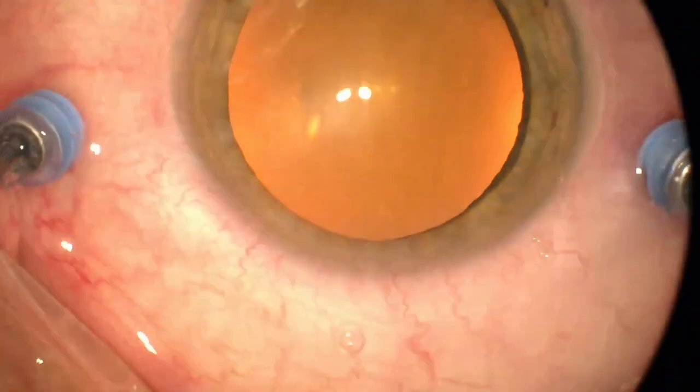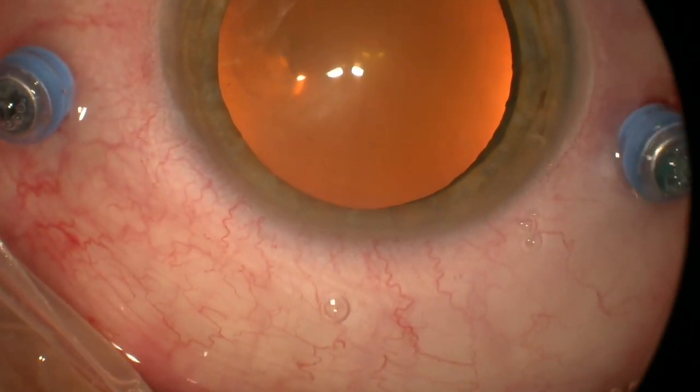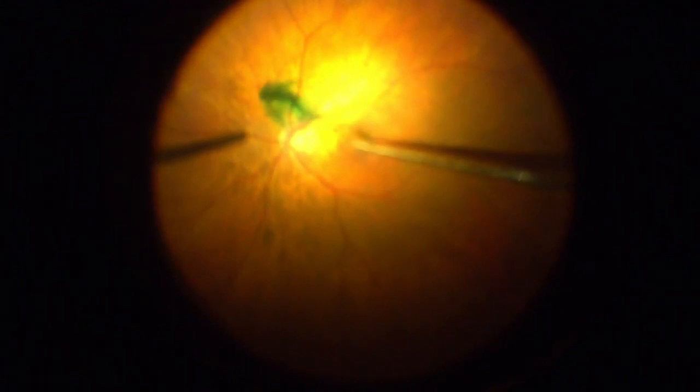Now we're going to move on to the staining piece of this. We're going to use ICG dye. Your cataract looks pretty good there. Jen, we're going to have to lay real quiet. That's the most important part, the peeling, okay? We don't want you to talk because it makes your head move. So here we go. We're going to get the ICG out. Watch, before she squirts, I'm just going to talk a little bit here. Sorry, Jenny. There you go.